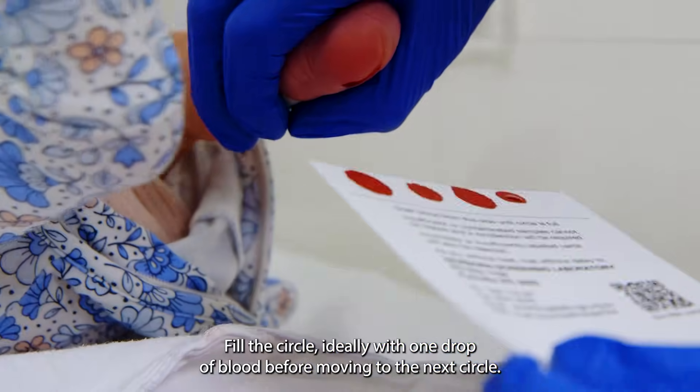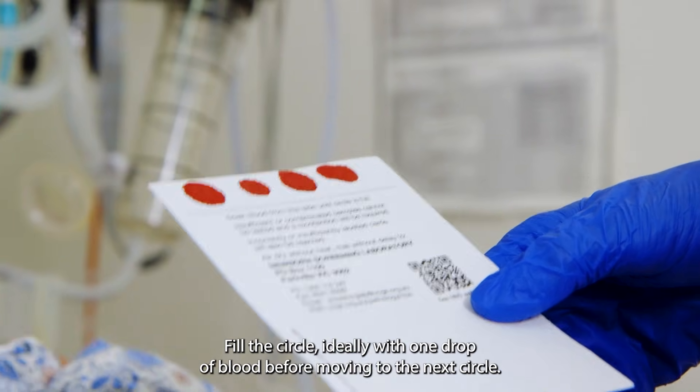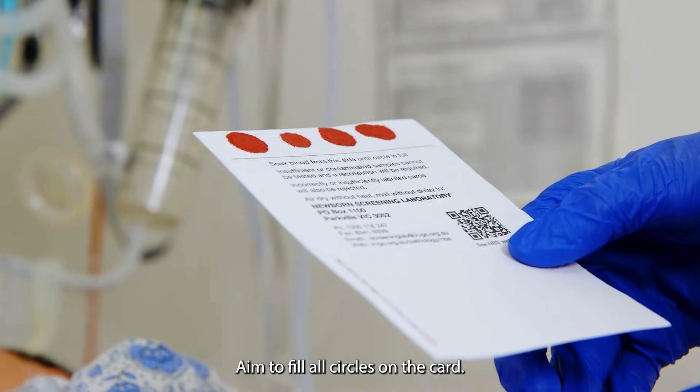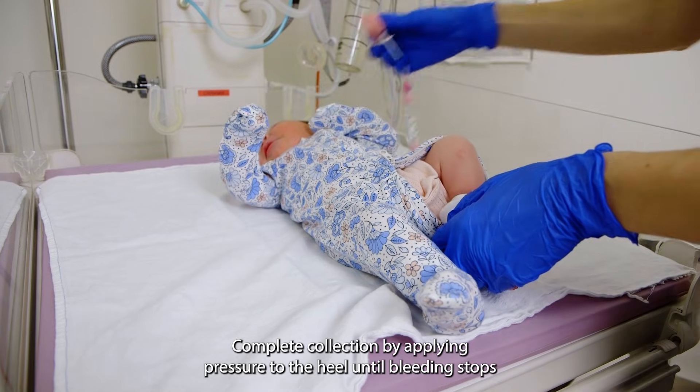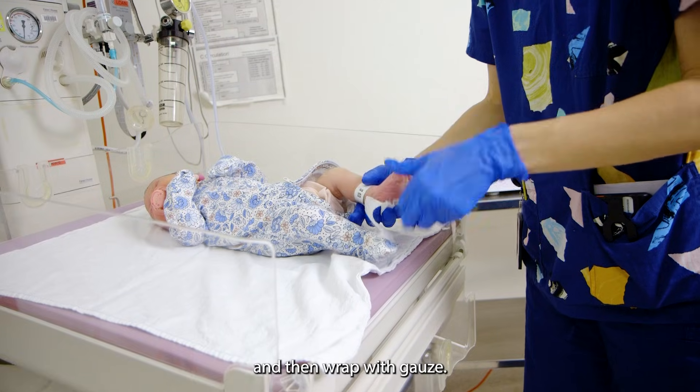Fill the circle, ideally with one drop of blood before moving to the next circle. Aim to fill all circles on the card. Complete collection by applying pressure to the heel until bleeding stops and then wrap with gauze.